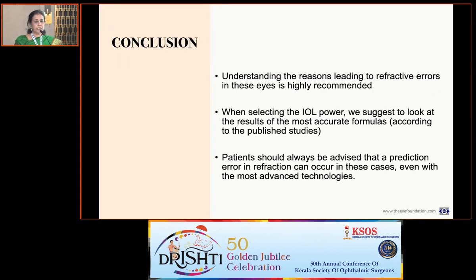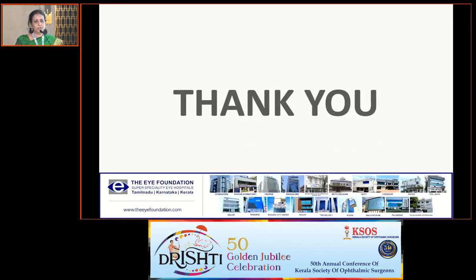If it is an irregular aberration, use an aberration-free lens. So in conclusion, what I would like to say is, we need to conceptualize that there is an error going to happen in the K value, in keratometric measurements, and in ELP. We need to use the solutions or the latest formulas which have given us an alternate approach. And if you thoroughly understand the science behind biometry, we would be able to do well with all our post-refractive surgery patients who come for cataract surgery.